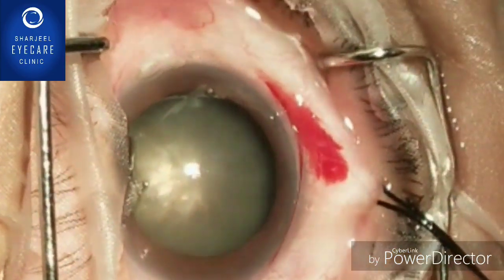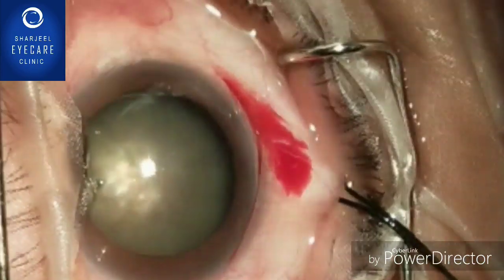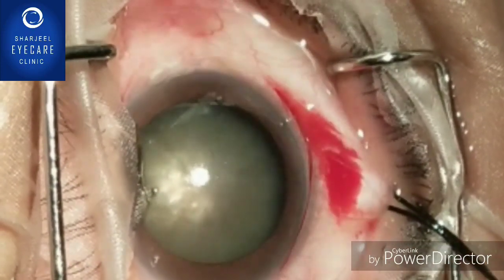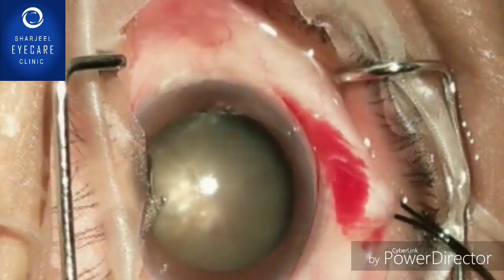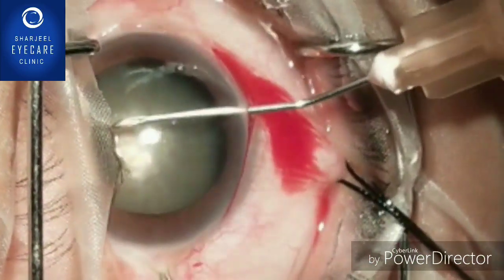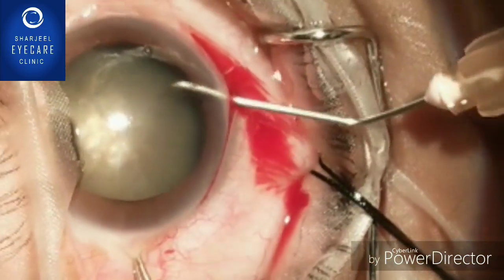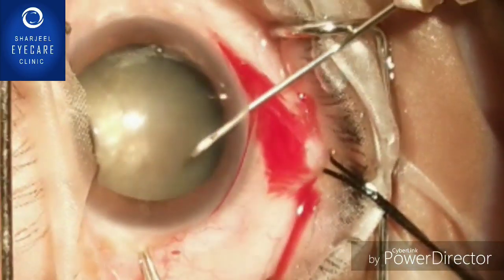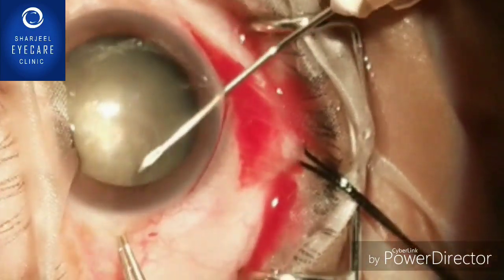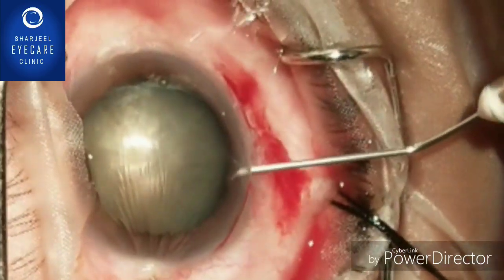We will try to show you in this video that for such a large subluxation, how to do cataract surgery without the aid of a capsular tension ring. The first important step is that you should not do the capsulotomy with cystotome or Utrata, because it increases the zonular dehiscence.